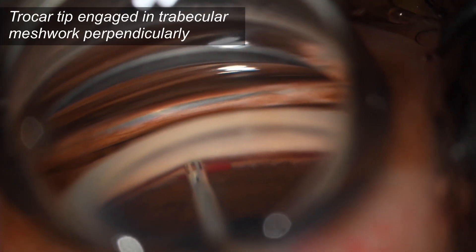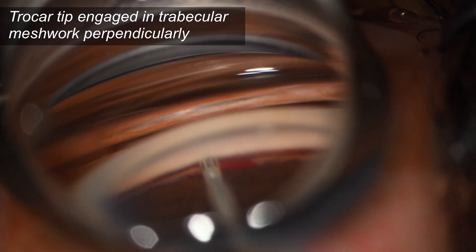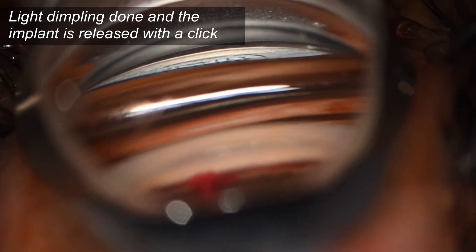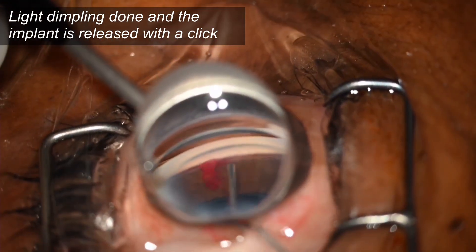For G2, the protective sleeve is retracted once the device is in the anterior chamber. The trocar tip is engaged at the trabecular meshwork perpendicularly. Light dimpling is done and the implant is released with a click.